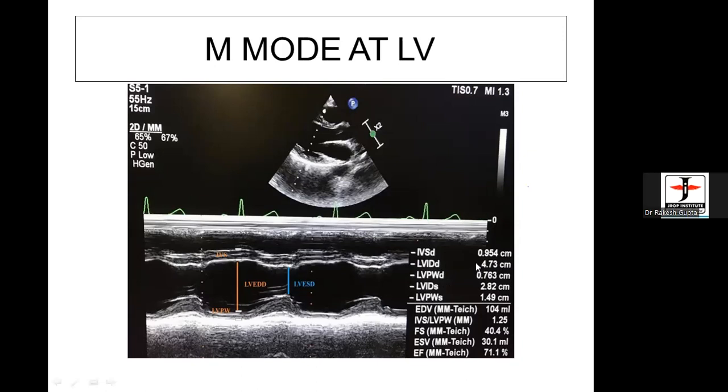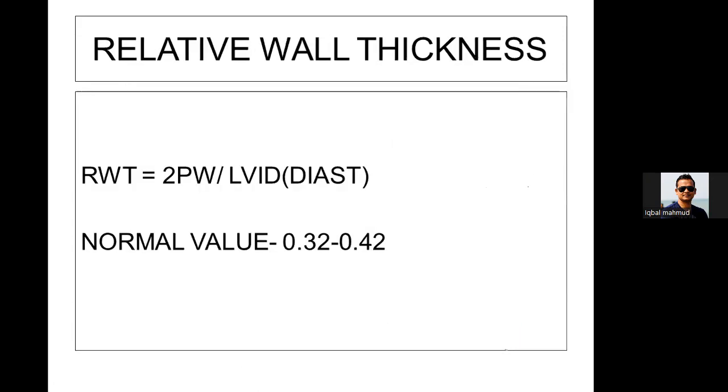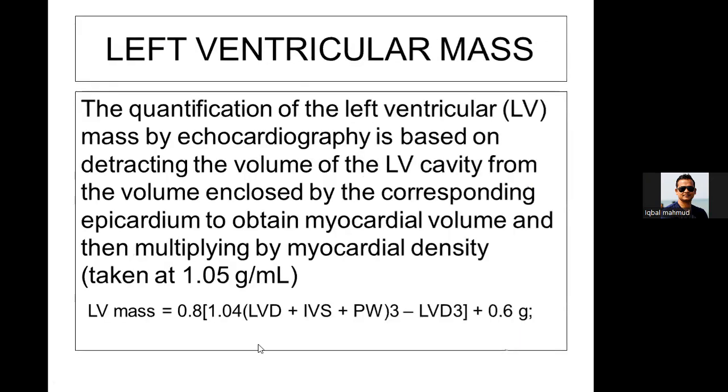Anybody else? Some questions before we go live? Mohammed. Sir, to determine hypertrophy, we need to know the LV mass, right? So how to get this LV mass? Is it by Simpson method or something?